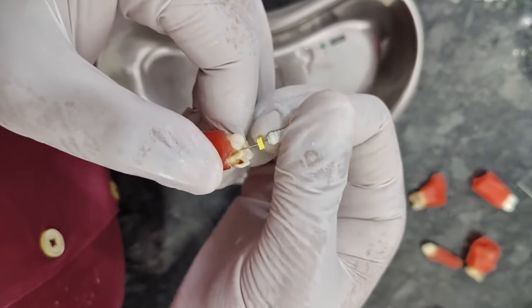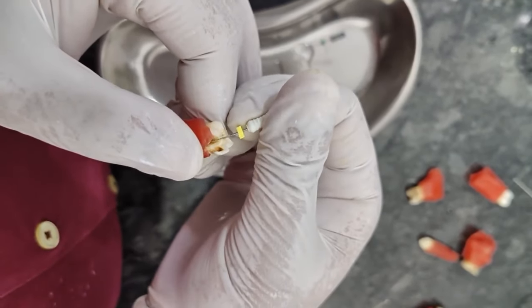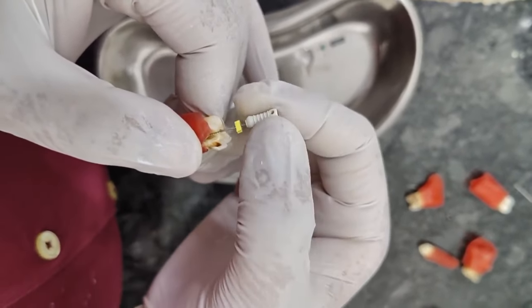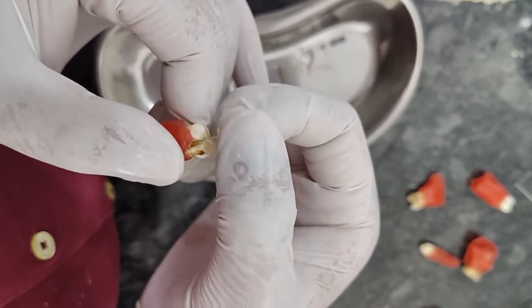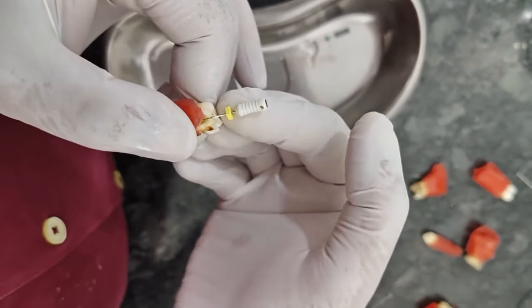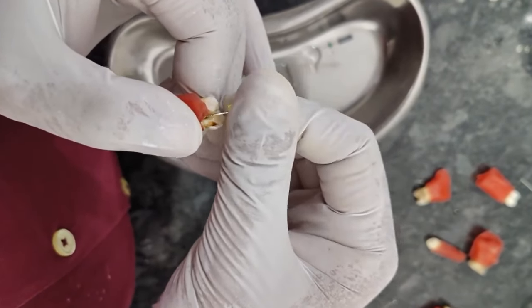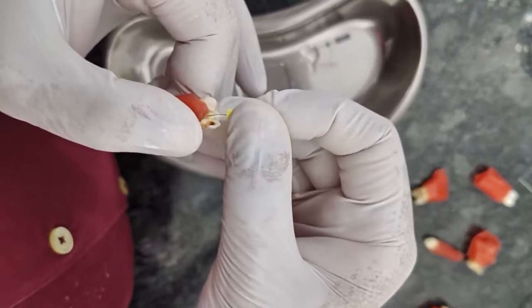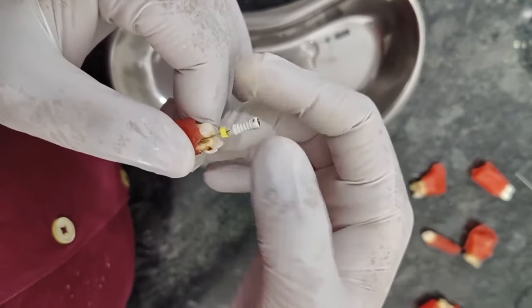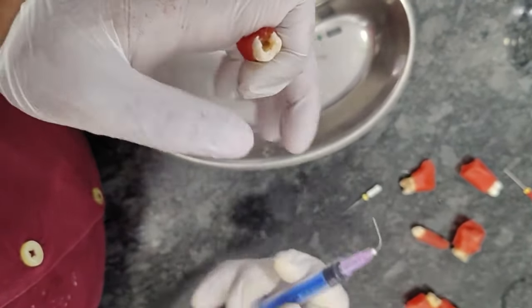So while giving pressure to the walls, we should give a light pressure like this and hold the file like this, and just don't bend the file too much. Just give a light amount of pressure on all the walls. Suppose now I'm pushing from this direction, mesial direction. So a little bit of pressure, then put it inside. Then from this direction, a little bit of pressure, put it inside. So the canal widens. And irrigation after every step is very important.